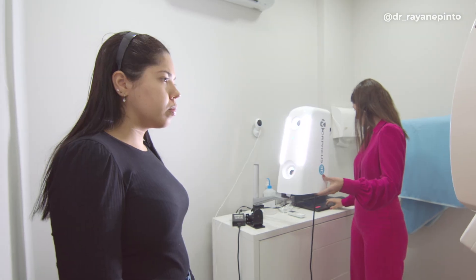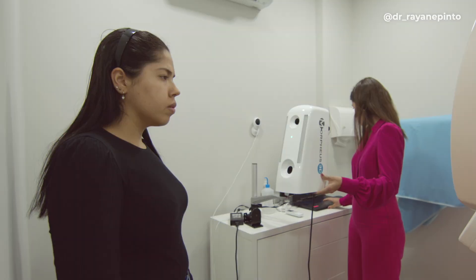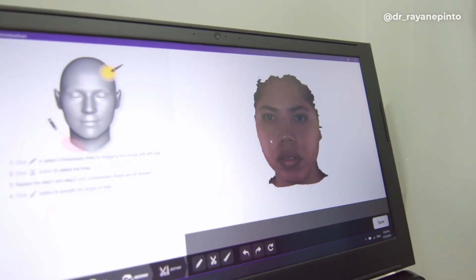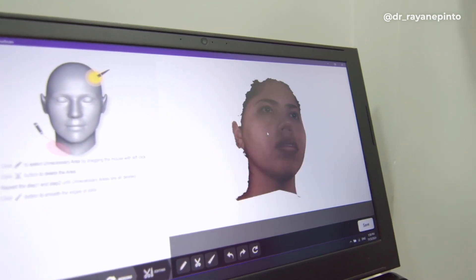It's a photograph of the patient looking straight ahead, then a photograph at about 45 degrees to the right side where the straight line coincides with the most posterior part, then a third photograph 45 degrees to the opposite side. After you have taken these photos, you just click on Merge, and then in just a few seconds your patient's face will be rendered in three dimensions — and that's when it begins.